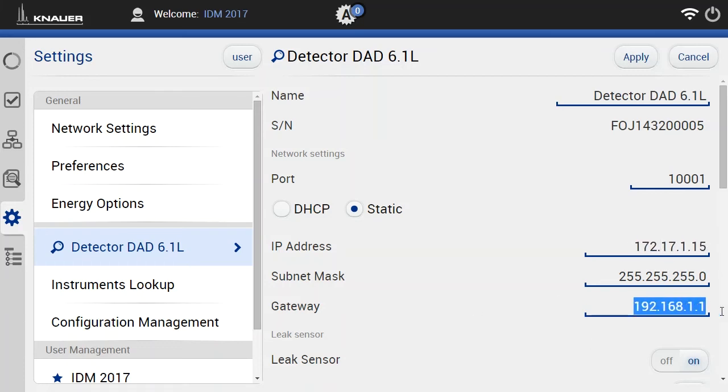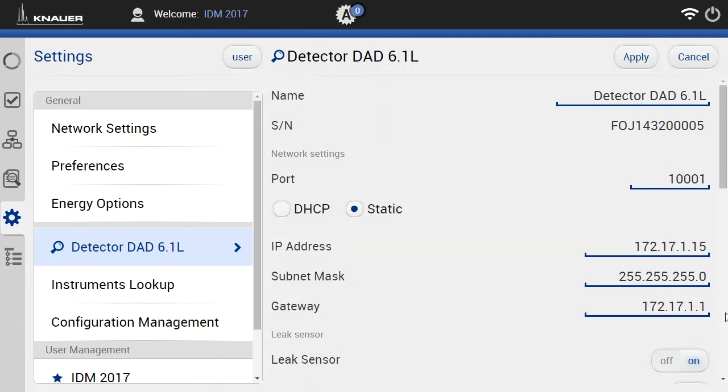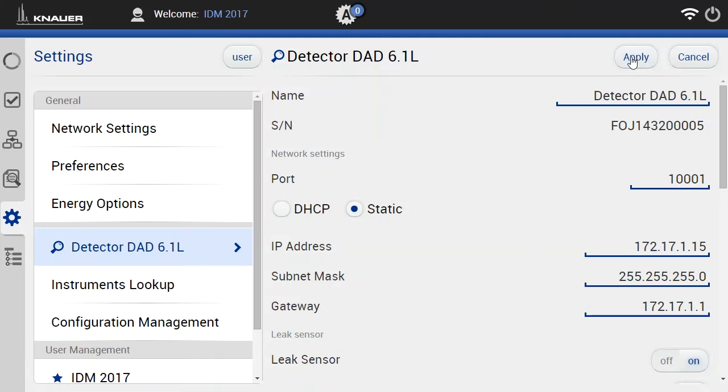You can also change the gateway of course. And if you have typed in all the numbers required, you can just click apply here. With this, the software sends the information to the instrument and now the detector has this IP number.